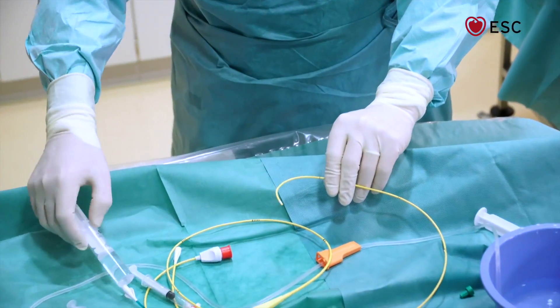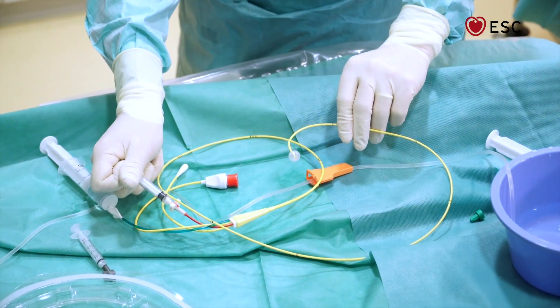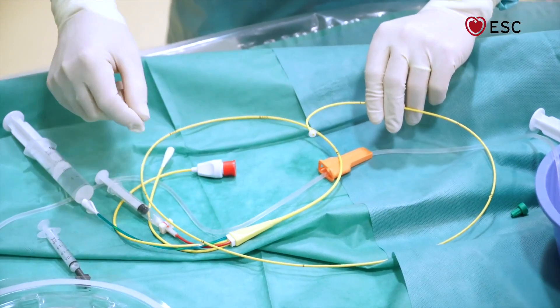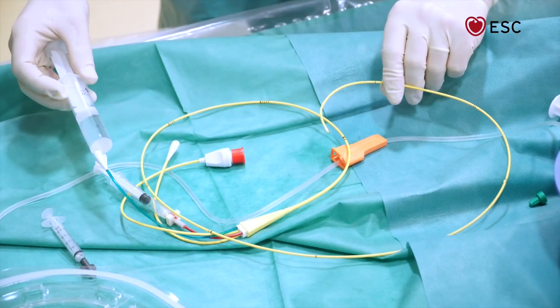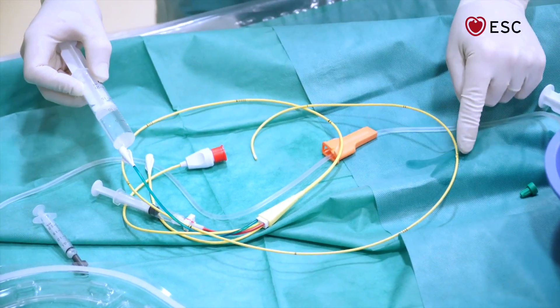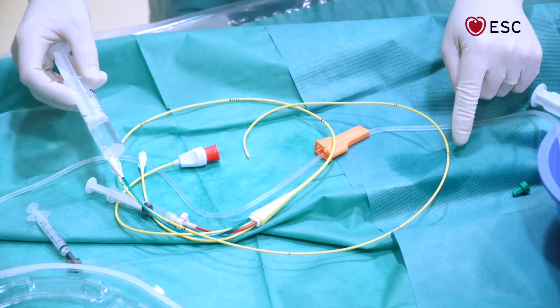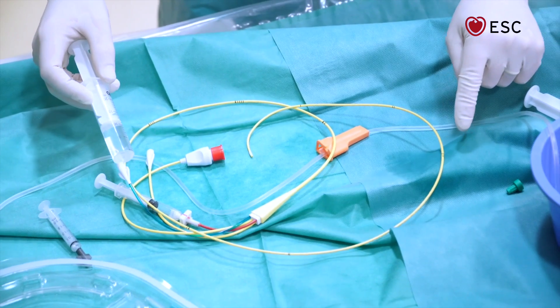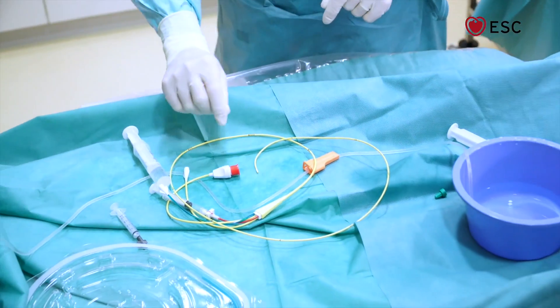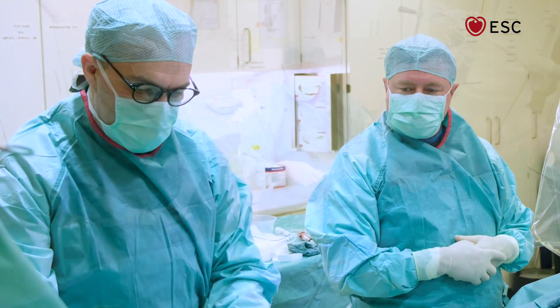The second catheter also has a balloon at the end for the same purpose. It has a distal port and a proximal port. Injecting through the proximal port, you can see it coming out at the 30 cm mark. The purpose is to inject cold saline so that, by using the temperature sensor at the end of the catheter, we can measure cardiac output by a thermodilution technique.